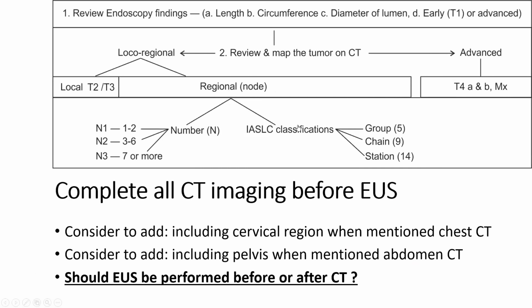So complete all CT imaging before EUS, and then consider adding cervical lymph node and pelvis imaging. If we are doing a complete CT, I think it must go to mid-thigh.